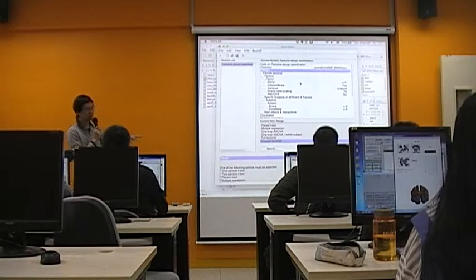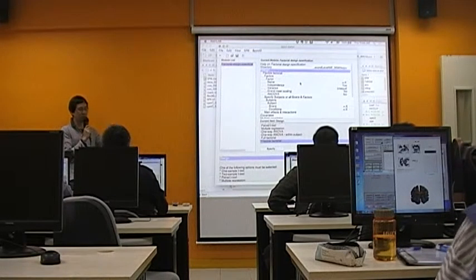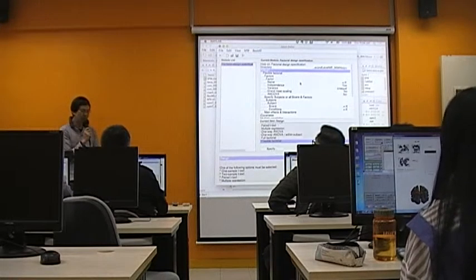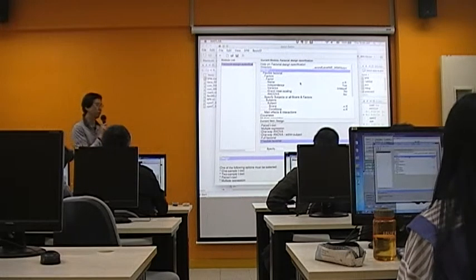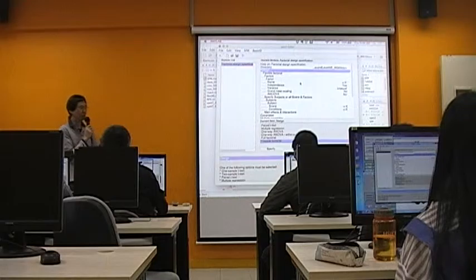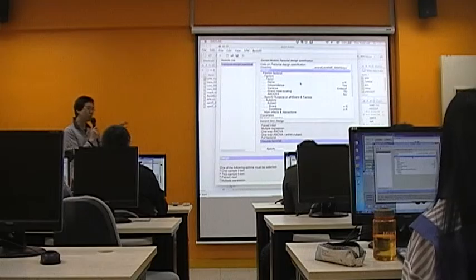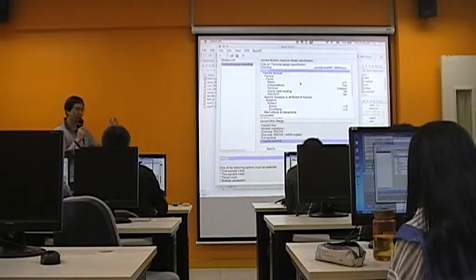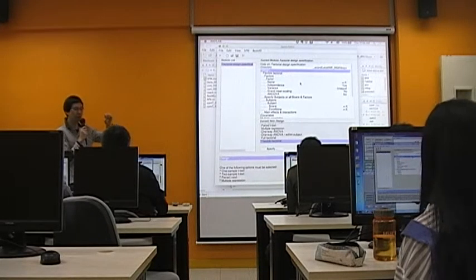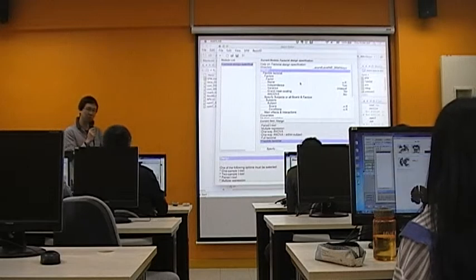By doing so, you are looking at each individual subject's corresponding beta image, putting it to the second level, and you could divide the expected variance with respect to the different conditions. For example, for the same subject, let's say you have two different betas. Let's say we model the one back task and the two back tasks separately. So there's only one beta for the one back task, and only one beta for the two back condition.